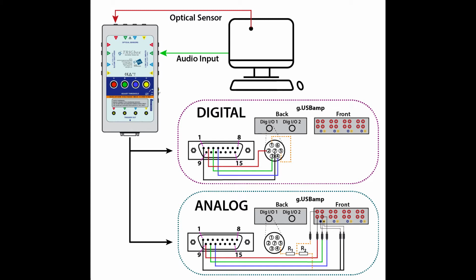We designed a custom cable to form all of these connections and demonstrate that the system latency can be evaluated with digital or analog inputs. However, this shouldn't be necessary. Stick to either digital or analog input methods to simplify your certification process.